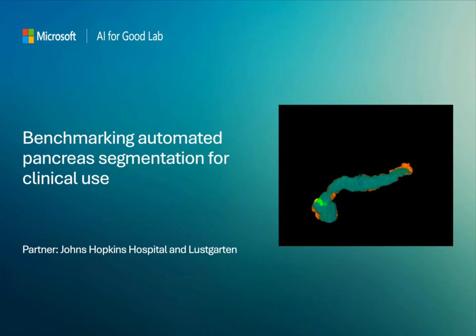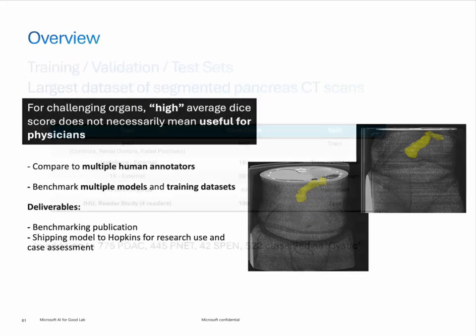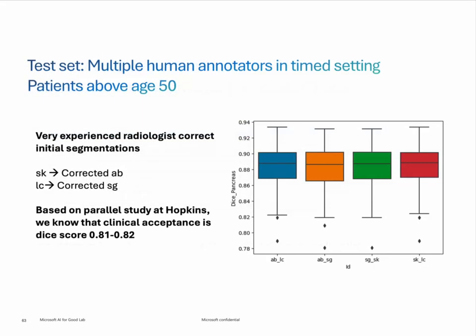Now, I mentioned that we draw by hand the pancreas. We are working, and others are working, on being able to isolate the pancreas. Here's some work we're doing with Microsoft. And just to show you, what we did here was looking at the DICE score for the computer automatically segmenting out the pancreas from the 3D volumes. We looked at normals, we looked at cancer, we looked at a range of different patients.